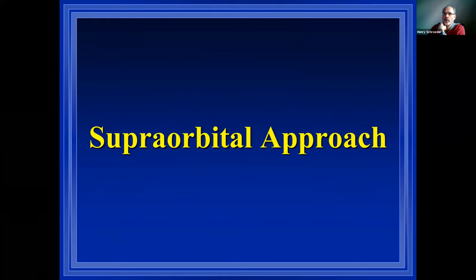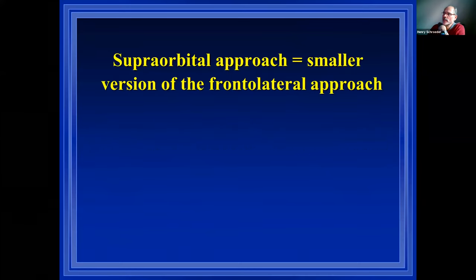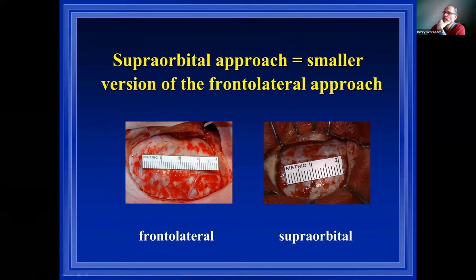So my topic is the endoscope-assisted eyebrow approach for parasellar lesions. You have heard from Marcos. He also used the term supraorbital approach for the frontolateral approach. In my department, we use the term frontolateral when we make the incision behind the hairline, and we use the term supraorbital when we make the incision through the eyebrow, just so the team doesn't mix it up and make the wrong incision. But basically, the frontolateral is the same as a supraorbital.